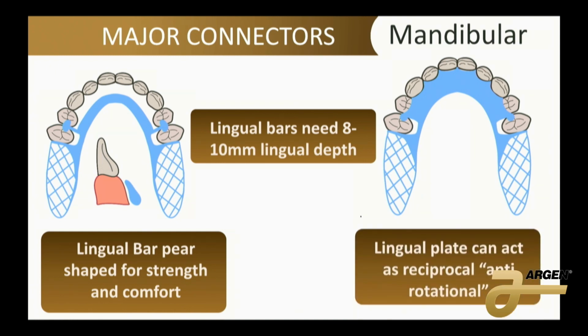Now, why you would use a lingual plate? Couple of reasons. One, you might not want to put rests on individual teeth. So if you just have 4 anteriors left and you don't want to torque one of them, put a plate across the whole surface of all of those teeth. That acts as your reciprocator for your fulcrum.